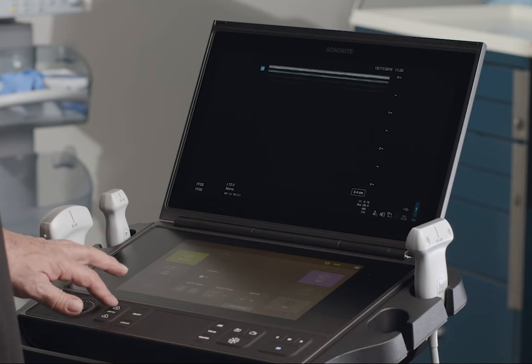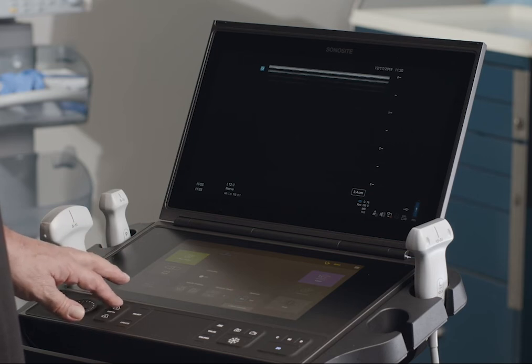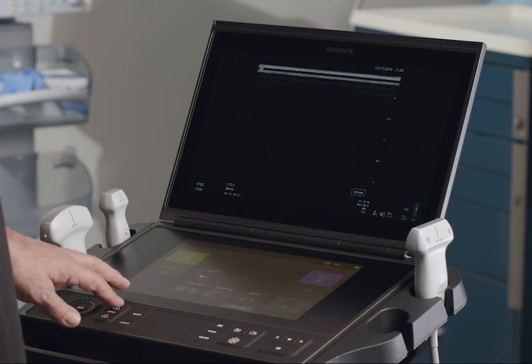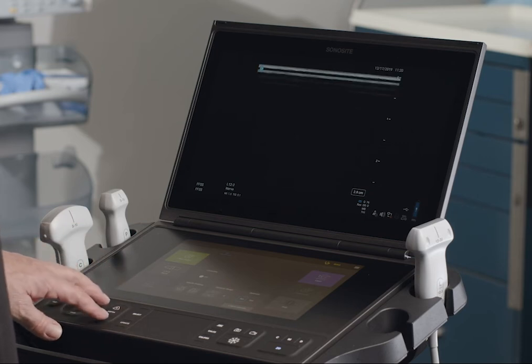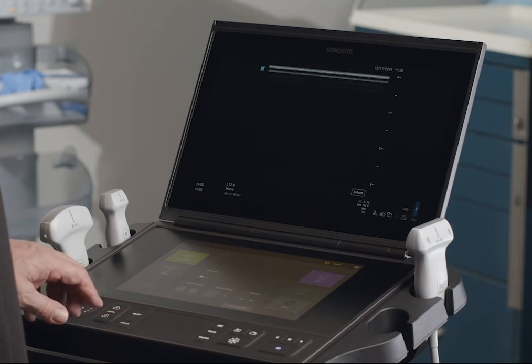Press the Upper Depth Control to decrease the displayed depth. Press the Lower Depth Control to increase the displayed depth.